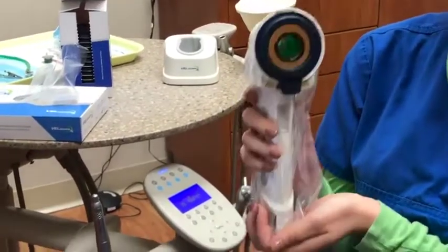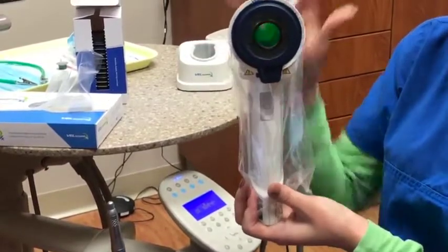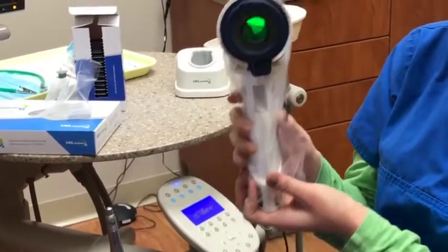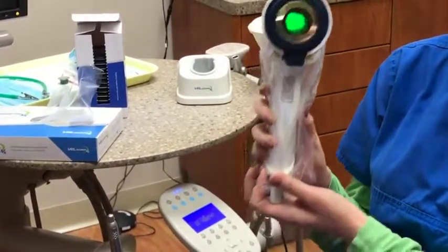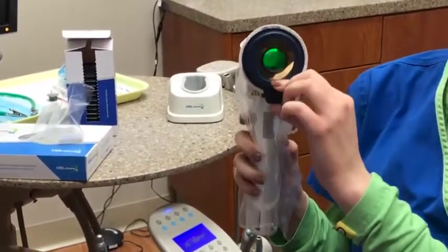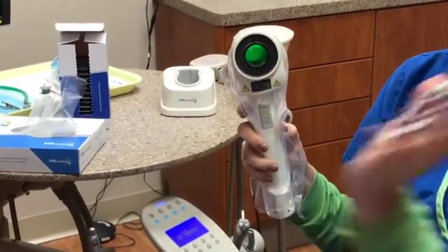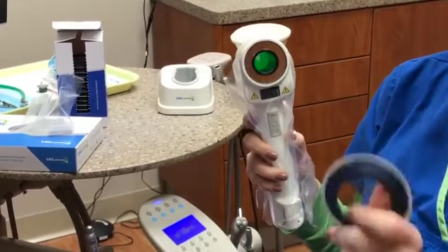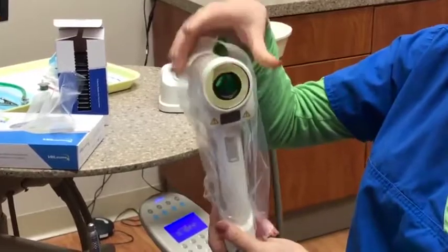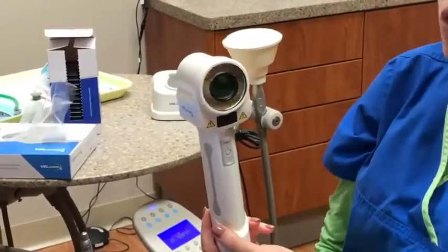Now we have to talk about disassembling. When we go to disassemble, as I mentioned before, both of these are one-time use only — meaning they can only be used once and then must be discarded. First we're going to take off the valve cap. The valve cap is a simple pop off — you're going to throw this in the trash and never reuse it. Same thing with the sheath: just like we put the sheath on then the cap, now it's the cap then the sheath. We take the sheath off and that gets tossed away as well.